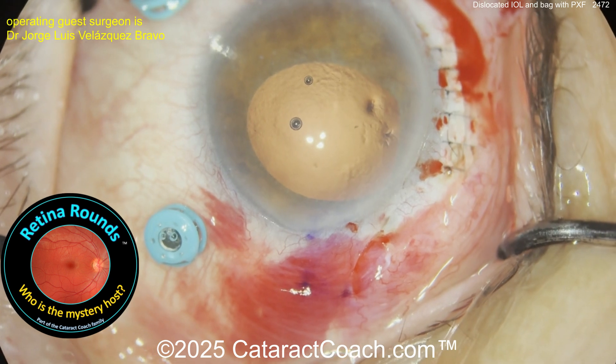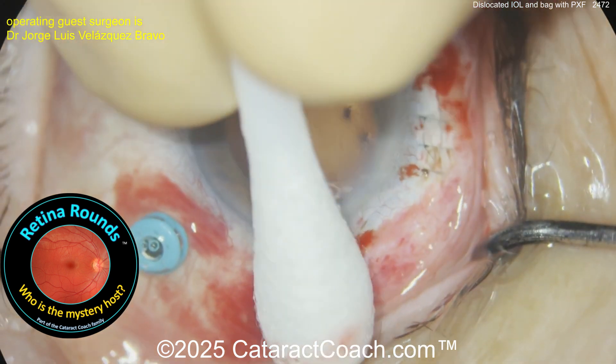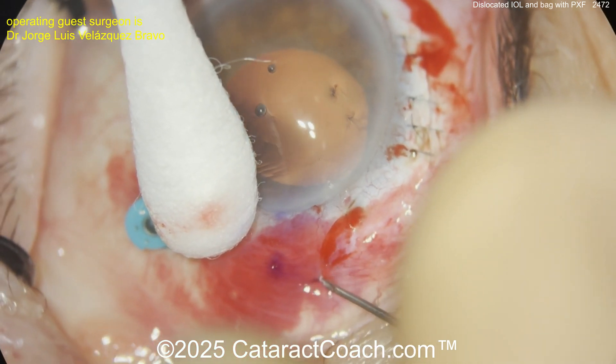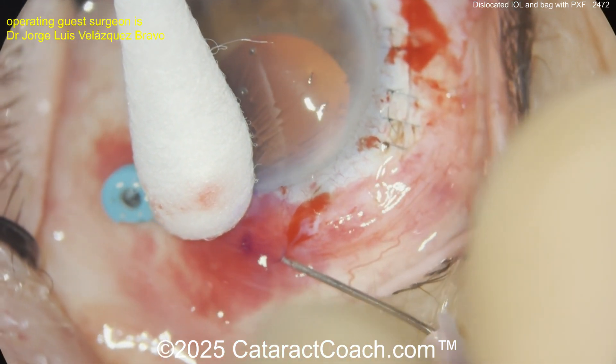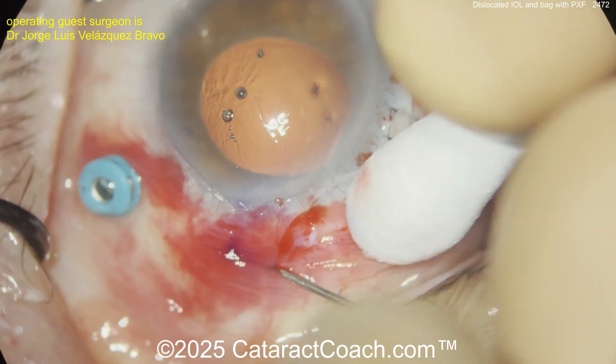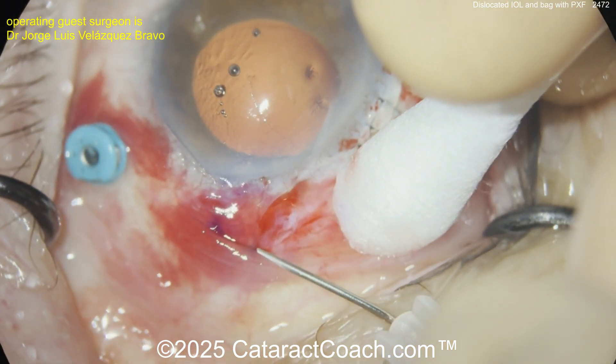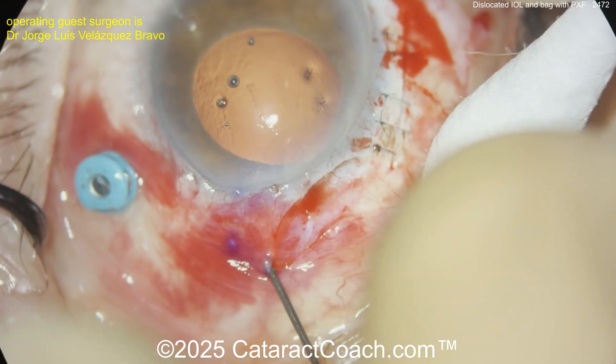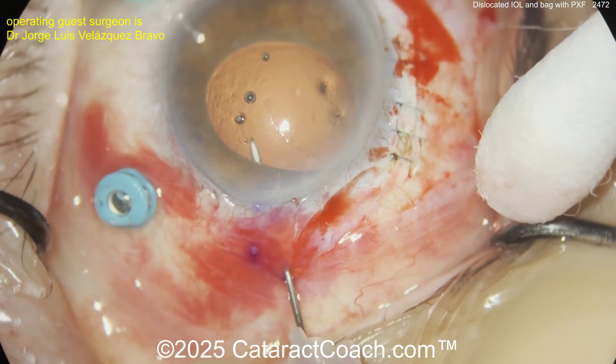Now looking over here, there are marks probably for placing a Yamane-style fixation — two millimeters from the limbus and then two millimeters to the side, getting a nice long two-millimeter tunnel there. I like that. Now entering inside the eye, and then the same will be done on the opposite side.